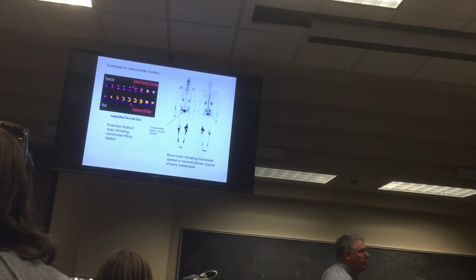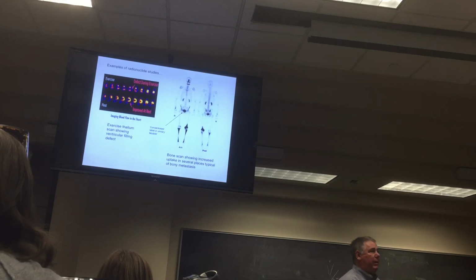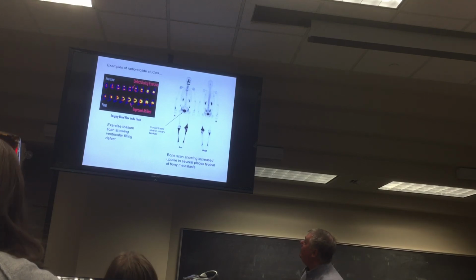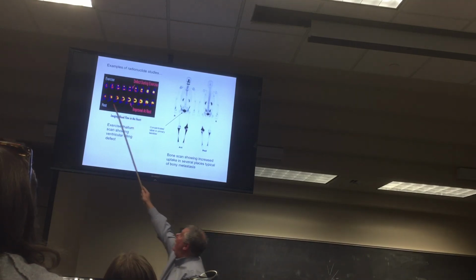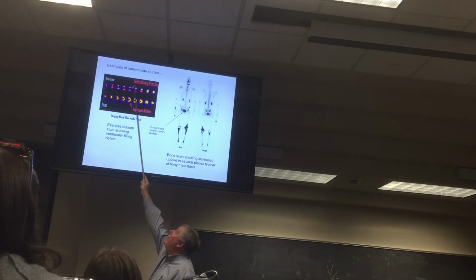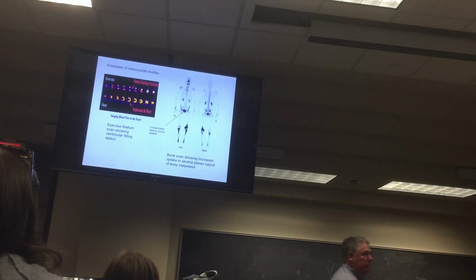What they do is they inject radioactive thallium that gets concentrated in the heart muscle. And they exercise you. And if you have dead heart tissue, scar tissue from MIs and whatnot, you're going to have a filling defect on a thallium scan. It's a wall motion problem. You can see here this nice perfect U, but you don't see that up here. So the apex of the heart of this person is affected. Okay.